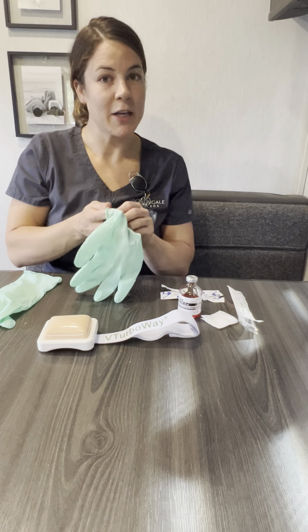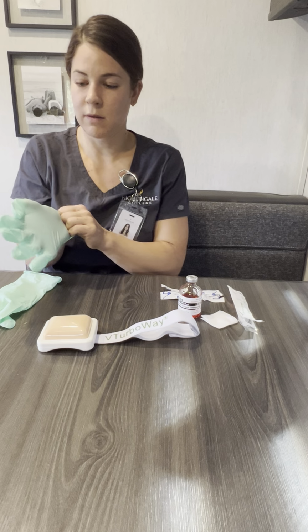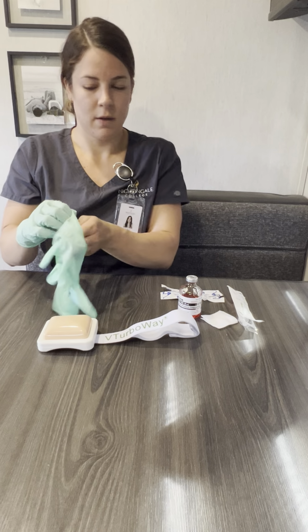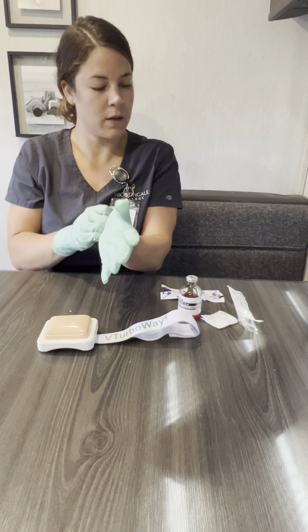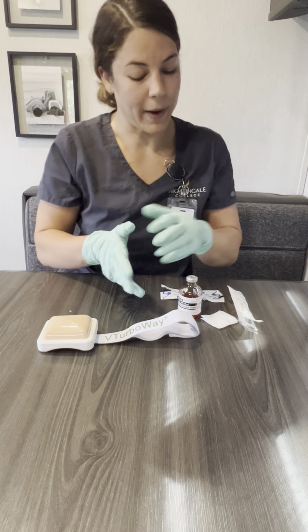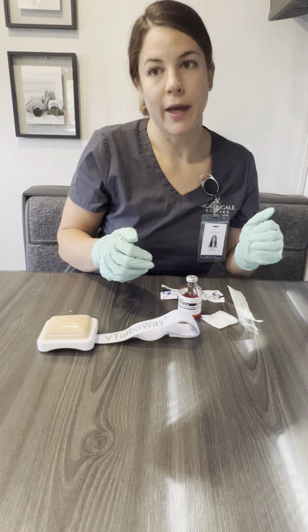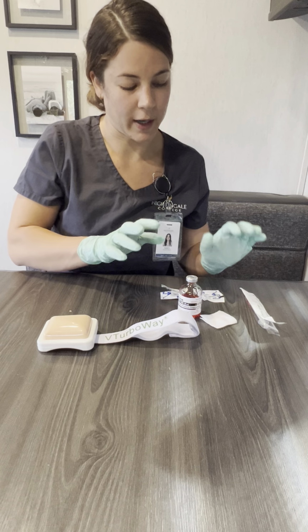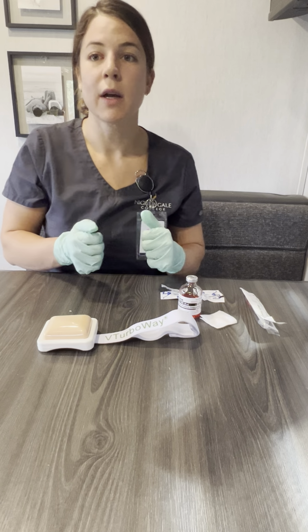I'm going to perform hand hygiene and then I'll put my gloves on. Alrighty. So now that I've verified for the second time in the MAR what my medication is, I will then go ahead and head over to my patient with the correct syringe, correct medication.